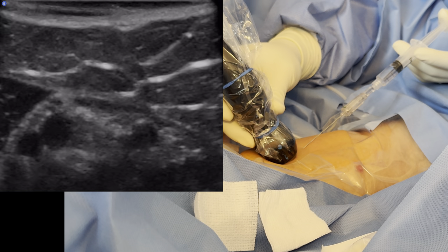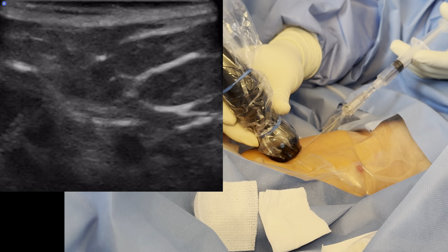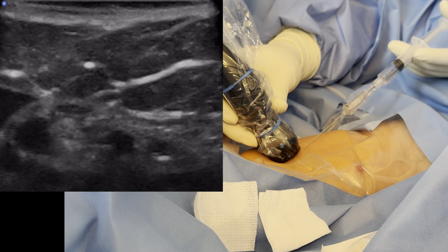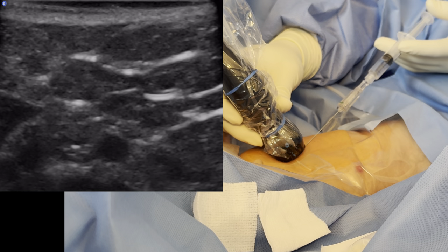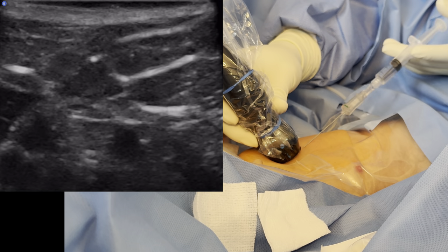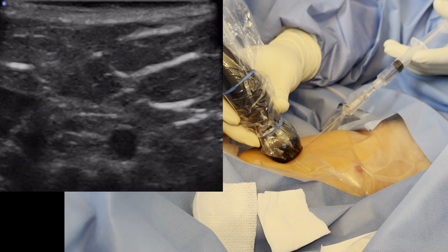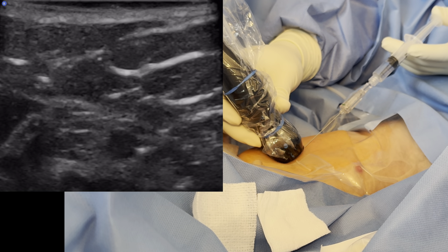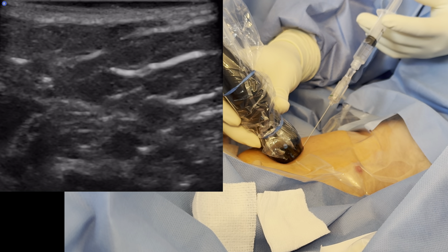Is that my tip or is that just a reflection? I think it's just tissue — because look at how dramatically even though it is a bright hyperechoic dot, when I dramatically move the needle, it's not moving with me. So I'm going to keep sliding forward. Now that dot — very bright — is moving as I'm moving the needle tip. How do I know that's a tip? Because when I slide the probe away from the field of view of the needle, I don't see the needle anymore. That's when you know you've gone past the edge of the needle. I'll bring the probe back until I start to see a small bit — that is a tip.